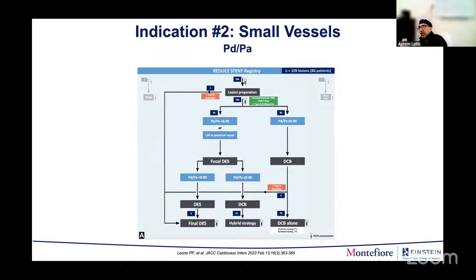The thing with rota is it sometimes softens the calcified plaque. Even when you do imaging, you can see where the rota passed because of the wire bias, and you can see the burr and the shaving of the calcium, but you may not see a fracture. So it's not that I'm reluctant about doing rota followed by DCB.